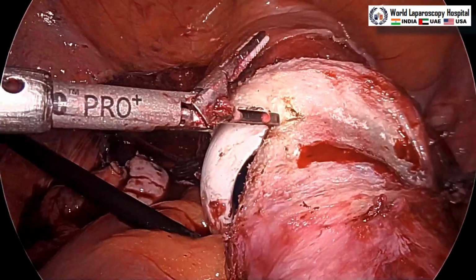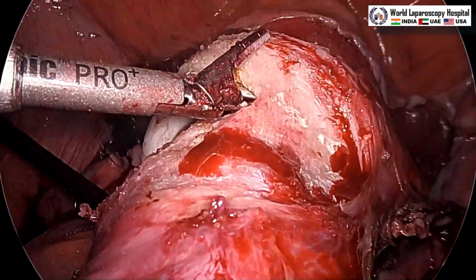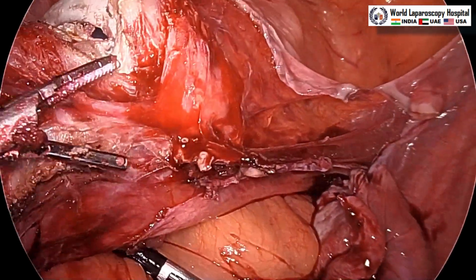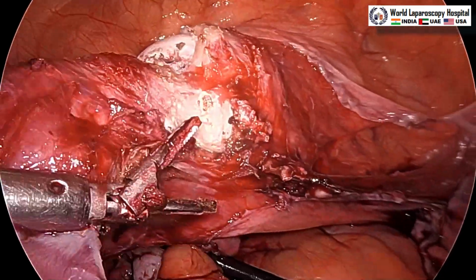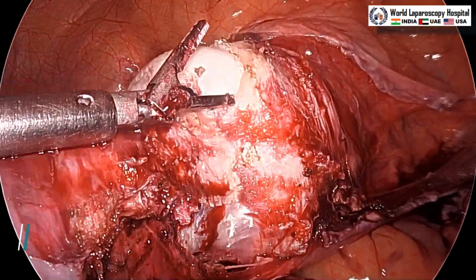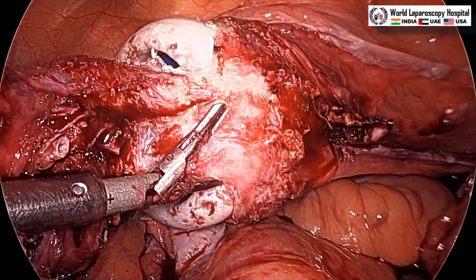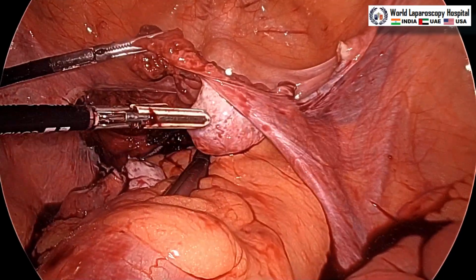So, this is the anterior leaf of the vault, and now the contralateral side. So, this total laparoscopic hysterectomy has not taken any time, hardly 15 to 20 minutes you can finish the TLH, because this was a simple case. So, it is done very fast. So, it is over. Now the uterus is pulled out with the colpotomizer.